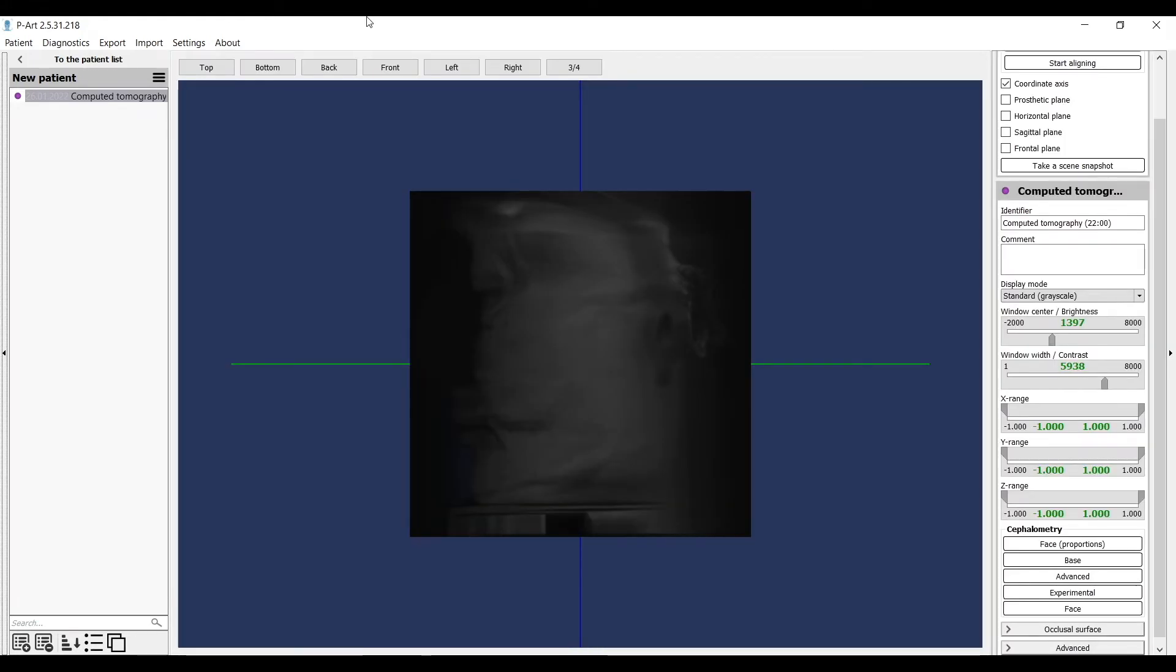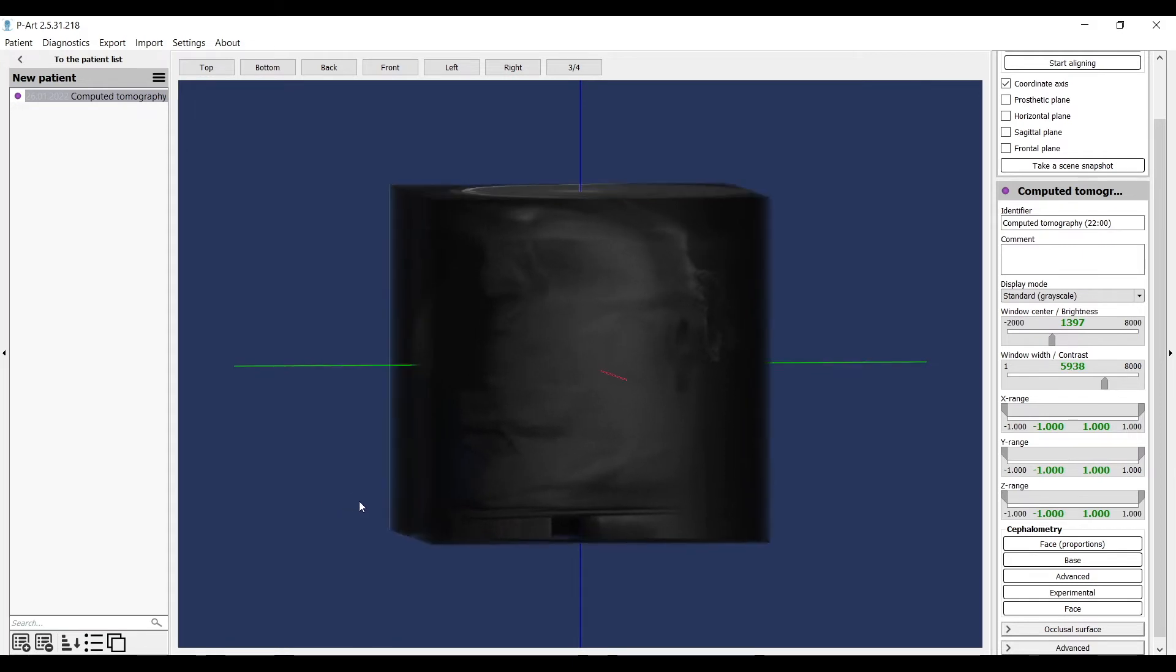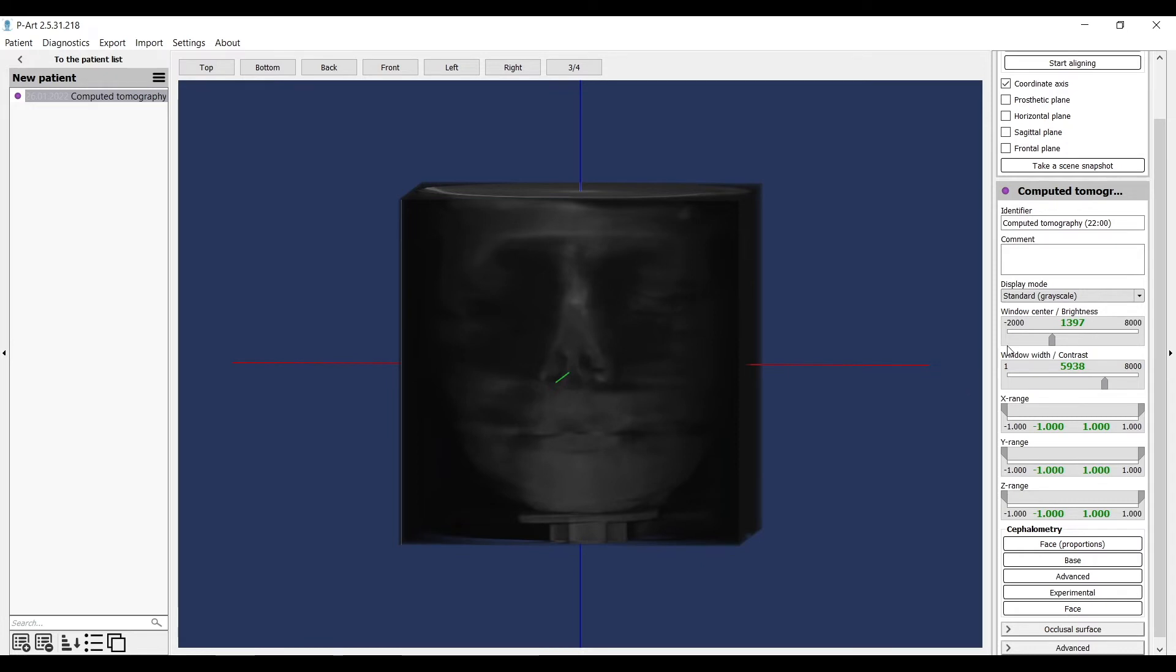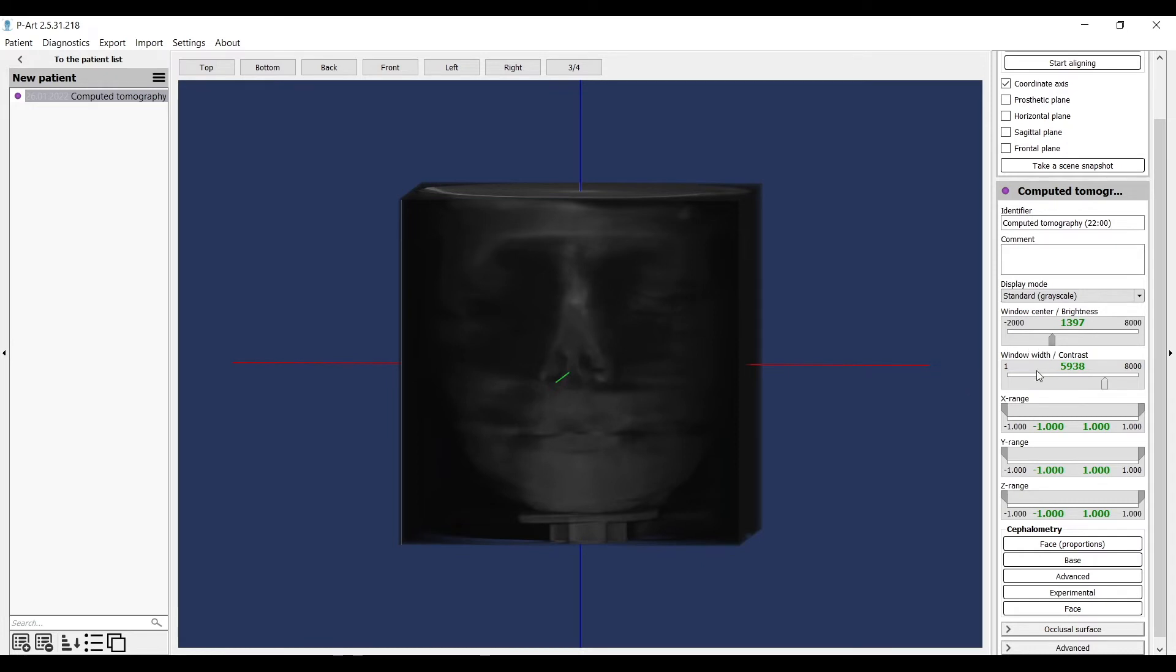When tomography is uploaded, we need to check the need for aligning. On the right side of the menu in the Tomography section, we can correct settings of the data.